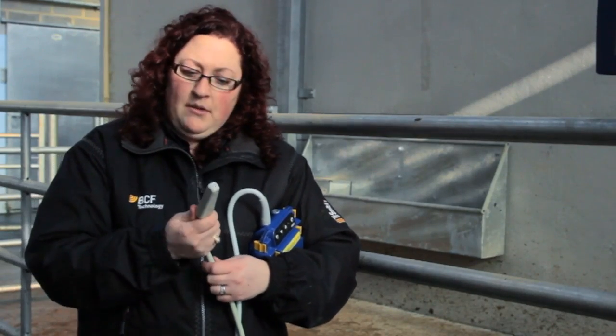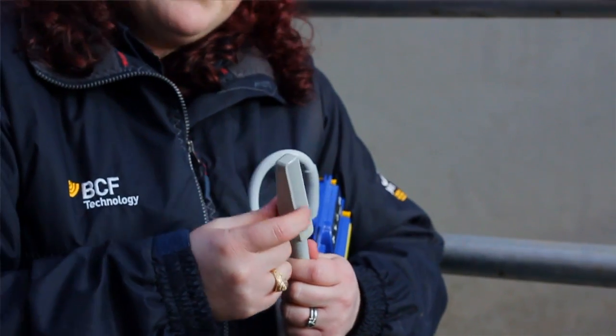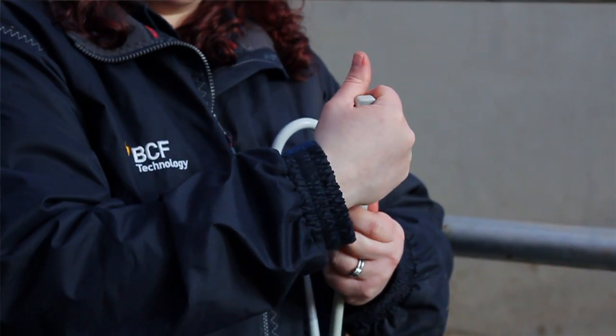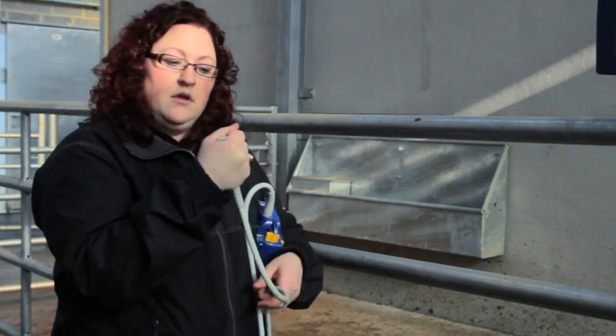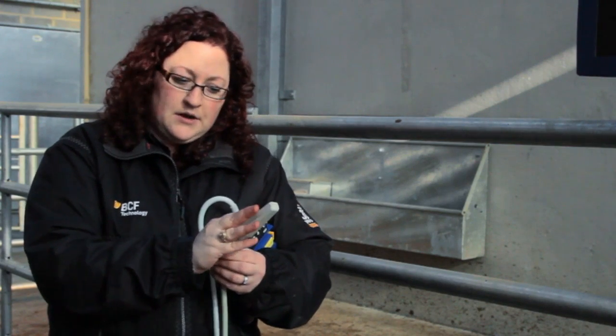Something to remember is that these crystals are sensitive and delicate, and we need to take care of them. Whenever you're holding the probe and it's not inside the cow, it's a good idea to cover the face of the probe with your hand to ensure that if you get knocked against a gate, it won't damage the crystals.